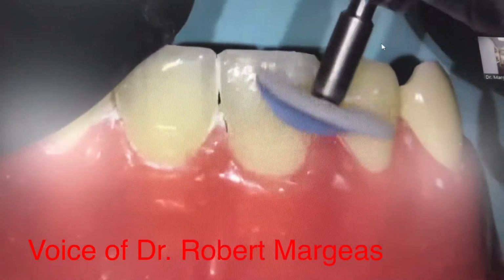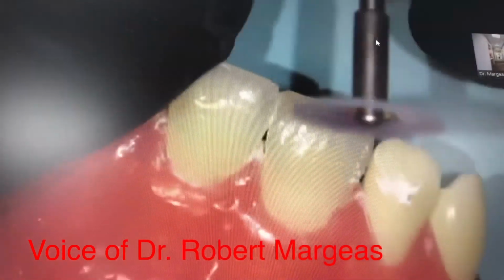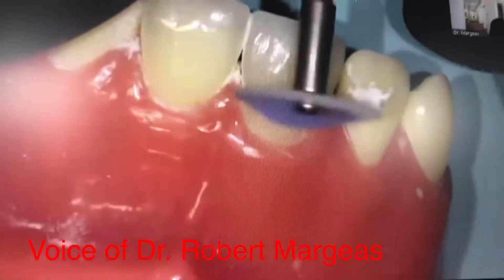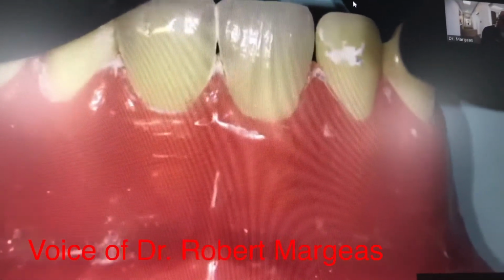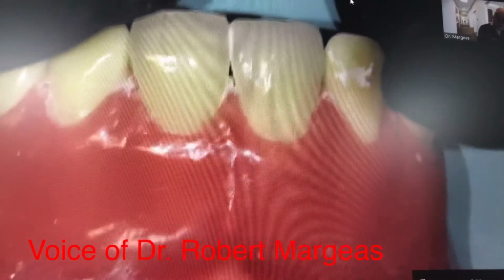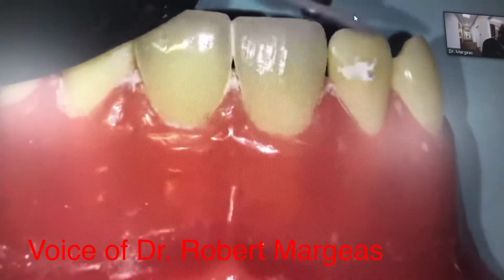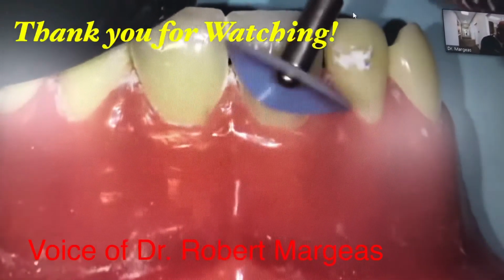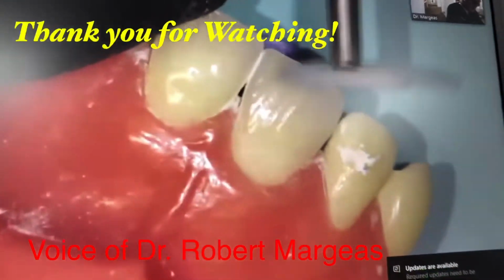This will show the surface texturing and the polish. Really, really nice. And that way you can get a really, really nice surface texture that looks more like a tooth versus just a smooth tooth. And this is from Cosmodent. And then I'll use either some Epitex strips from GC or Flexi strips from Cosmodent.